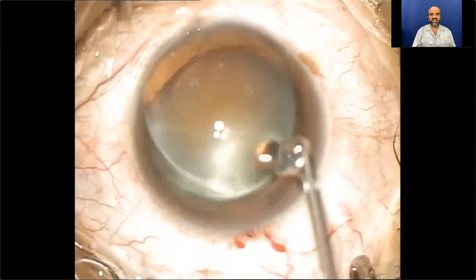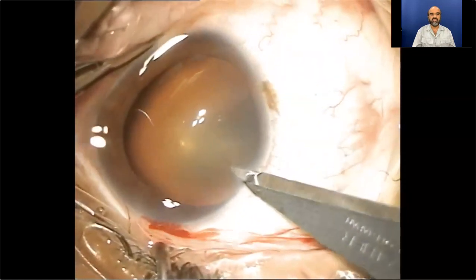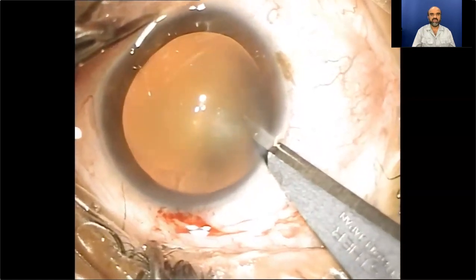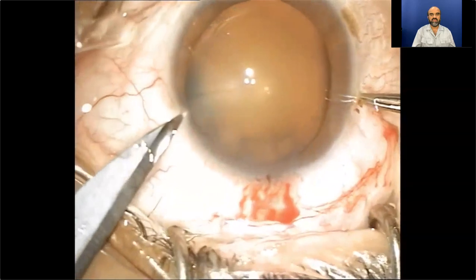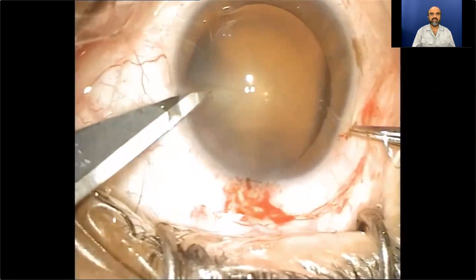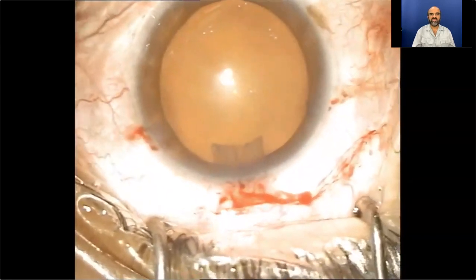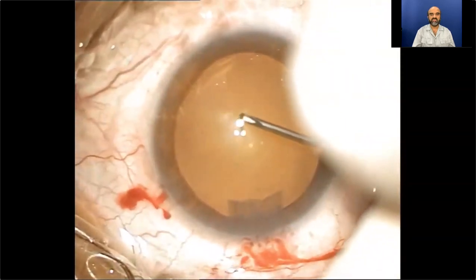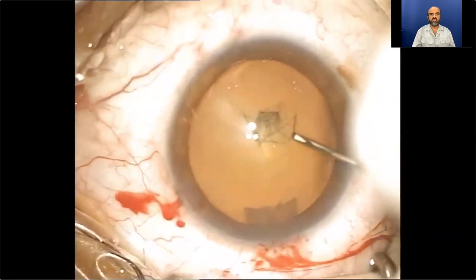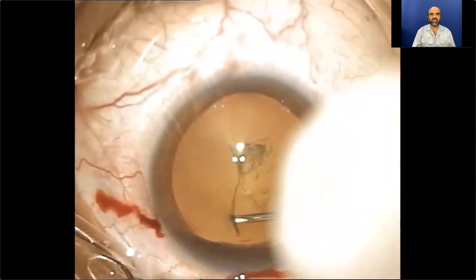The anterior chamber is filled with viscoelastic material, and a little viscoelastic is spread over the corneal surface. Then two side port incisions are fashioned on both sides of the phaco incision, because my preference is bi-manual irrigation aspiration. The 27-gauge needle enters from the side port incision.